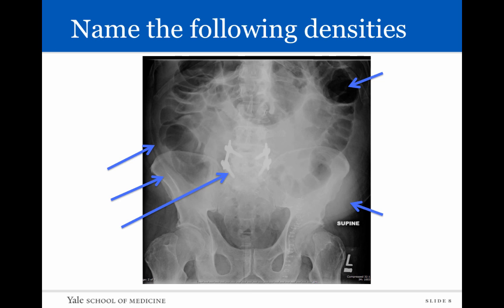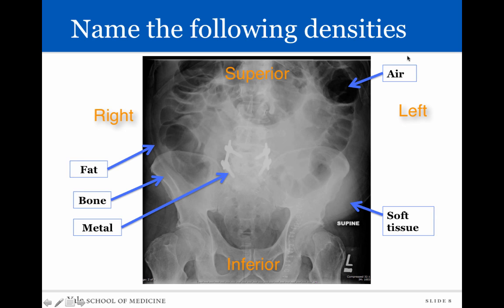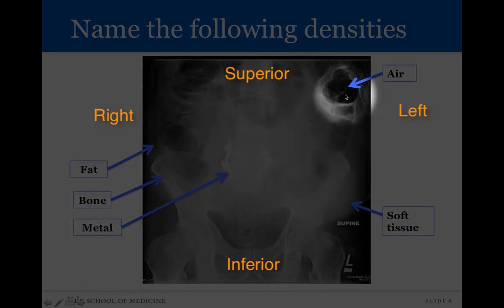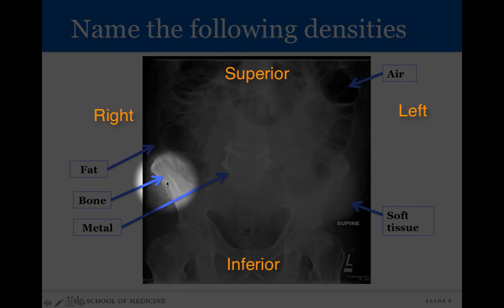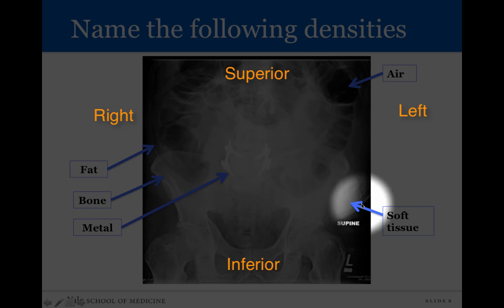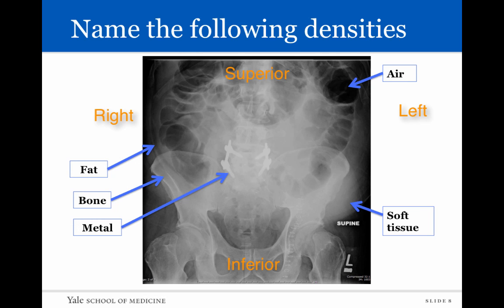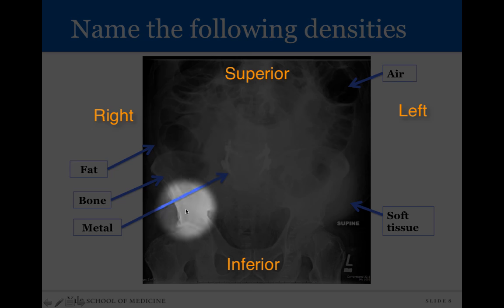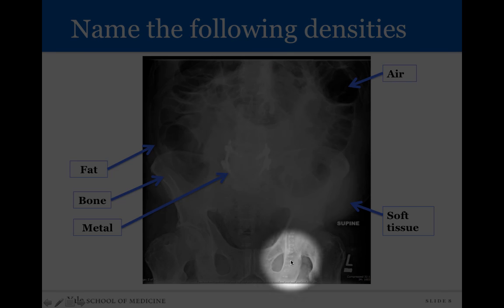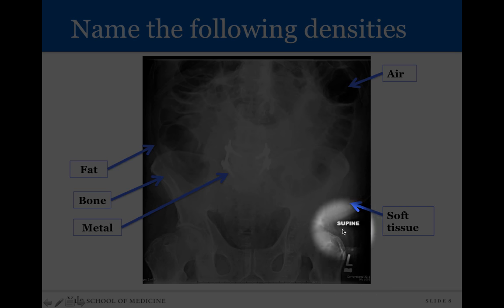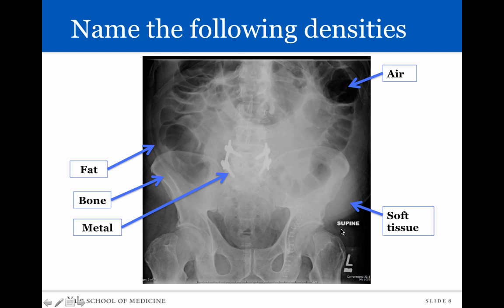Looking at this radiograph of the abdomen — oriented with the head up, feet down, right side here, left side there — see if you can identify the five densities. The darkest area in the left upper quadrant is going to be air. The brightest is going to be metal. Bone is the next brightest, white but not as bright as metal. Soft tissue — including subcutaneous fat, organs, and fluid in the body — will all have a relatively white appearance. Fat will be somewhere between the densities of soft tissue and air, relatively dark but not as dark as air — that little strip over there. There are also surgical clips visible in the left groin area, as well as markers indicating supine and left side showing patient positioning.